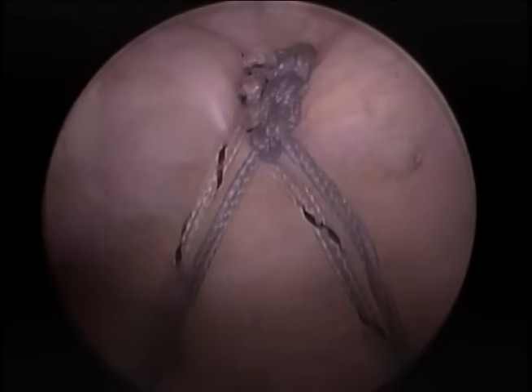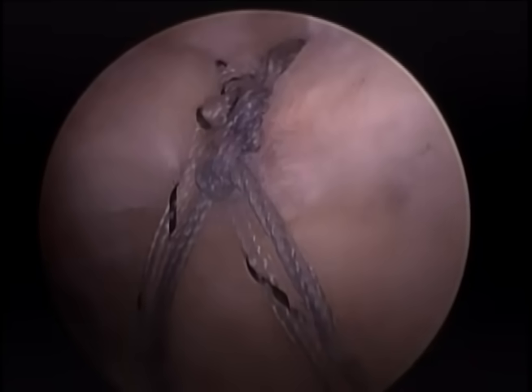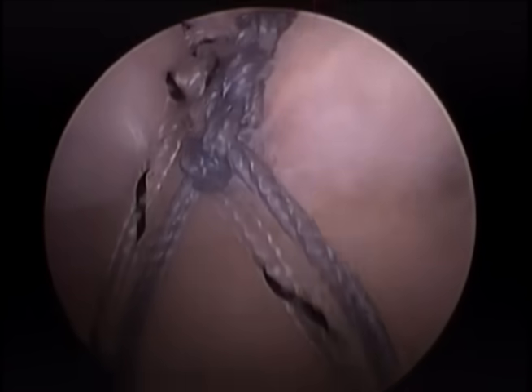See how the sutures are all tied medially in the tendon, and the ends are pulled over the lateral aspect of the tendon to this lateral row of anchors. The tendon is pulled flush over the greater tuberosity footprint, increasing the surface area for tendon healing to bone. We internally and externally rotate the arm, and you can see a solid repair that is quite stable.